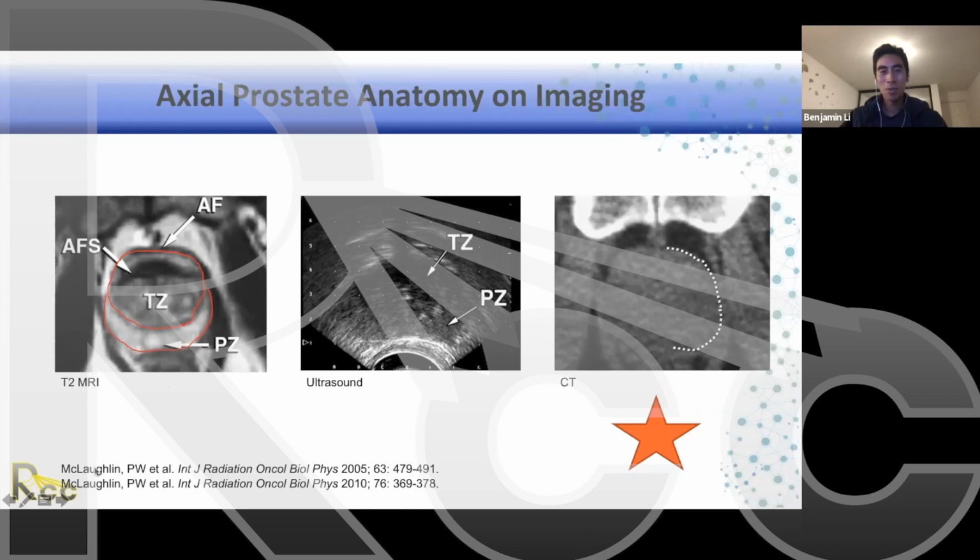So there are some nuances with our contouring. So yeah, that would be great. I think a necessary session for the future for this group. But again, the thrust of tonight's conversation will be CT-based planning. And there are pitfalls of MRI, and we can maybe even look at some of those cases here.